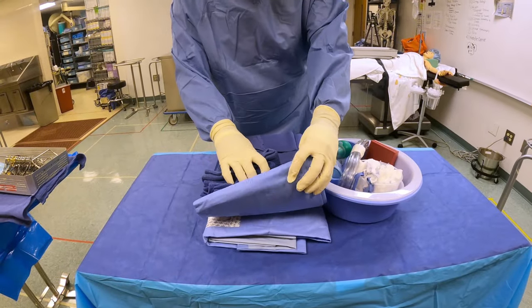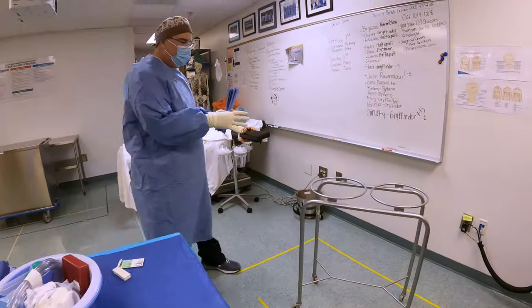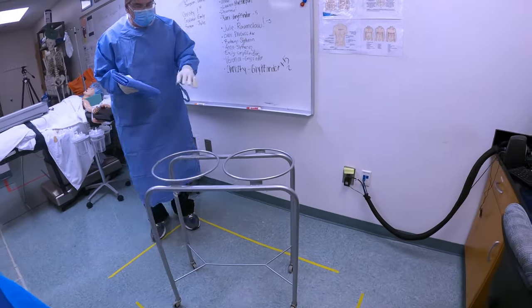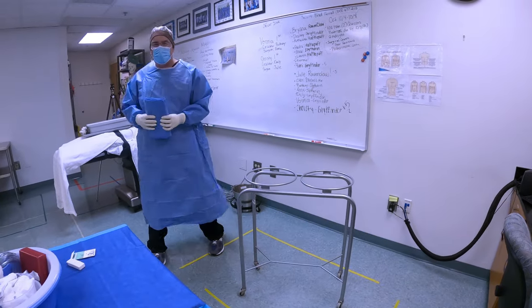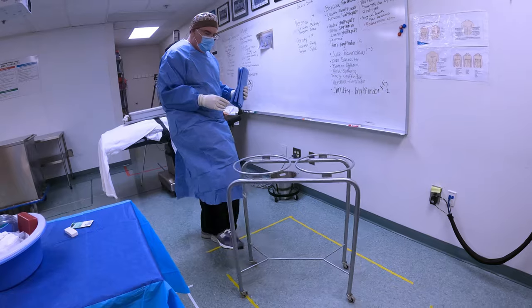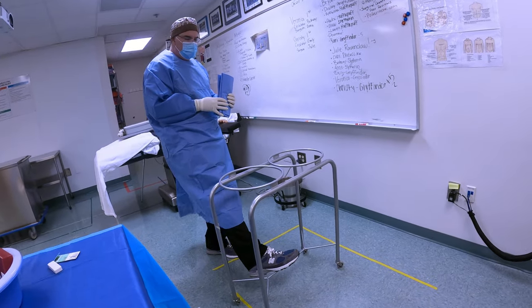But I have everything else in the way first. So as soon as I can, let's expand that sterile field — and that next item is going to be the ring stand. I'm going to grab my ring stand cover, my half sheet, and come over here. Now I can't touch this thing, and I kind of want to be on this side in order to drape it properly, but that gets me a little too close to that wall. So I'm going to use my foot to turn it around like that.